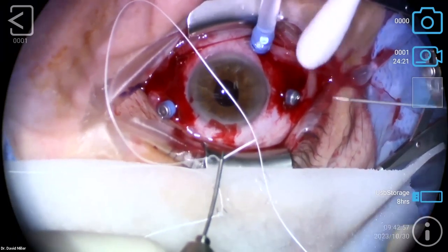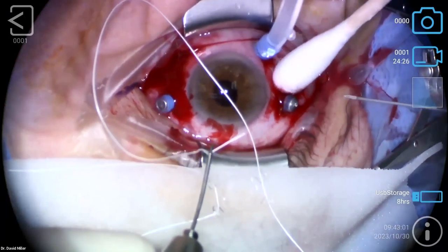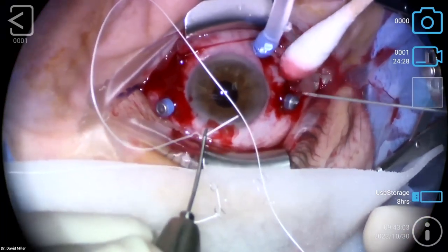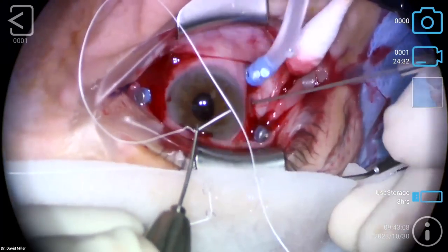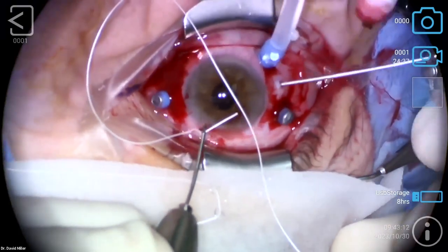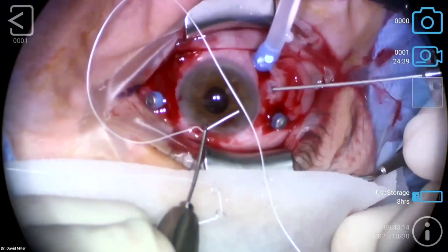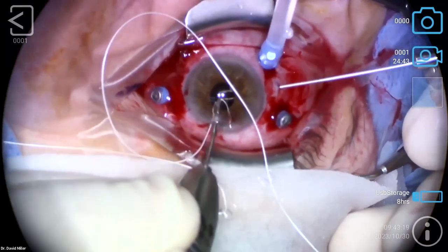You got a Q-tip? This is where it kind of comes over, wipe it, just wipe that blood away a little bit more. And I think it's right there, right? Helps to have a good assistant. Now the pupil is a little small, but that shouldn't bother us too much at this point in the case. That's from the trauma of pulling out the other lens.